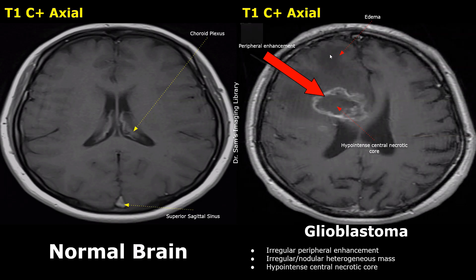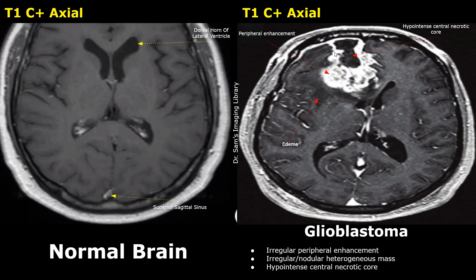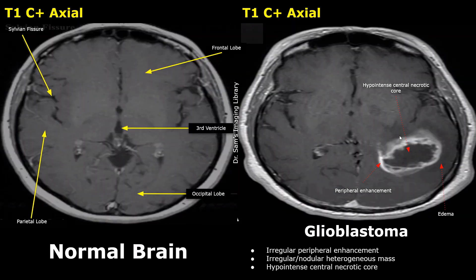These dark grey-colored areas near the mass are edema. There is effacement of the sulci. Mass effect has led to ventricular compression and a midline shift. This is another case of glioblastoma — an irregularly shaped mass in the frontal lobe. There is strong heterogeneous peripheral enhancement surrounding a dark hypo-intense central core. Edema can also be noted near the mass. It is an irregularly shaped mass with peripheral enhancement and a hypo-intense central core in a T1 contrast image.